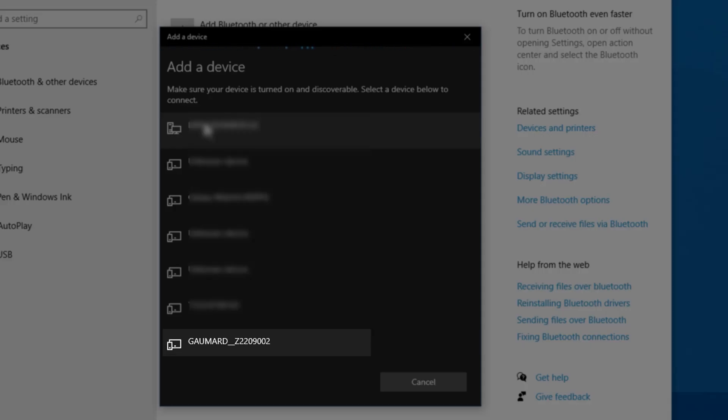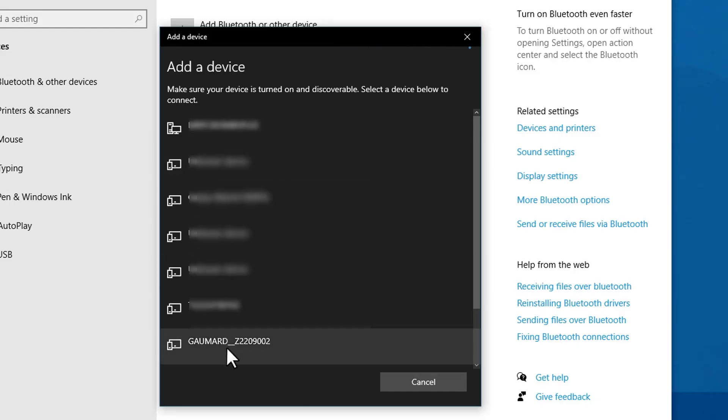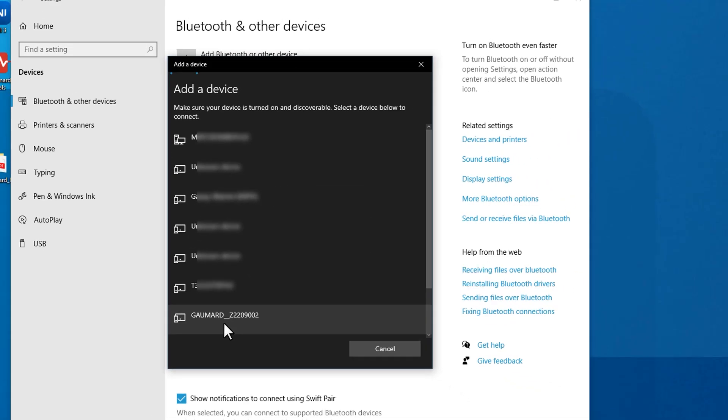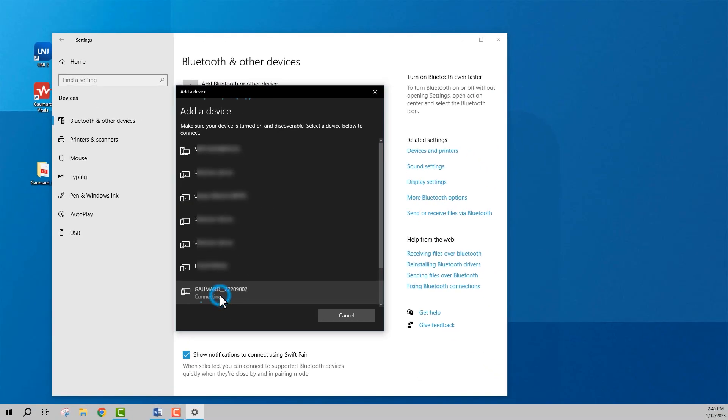Once your simulator's serial number appears in the menu, click it and follow the on-screen instructions to finish the pairing.